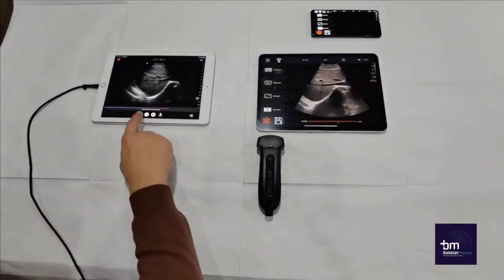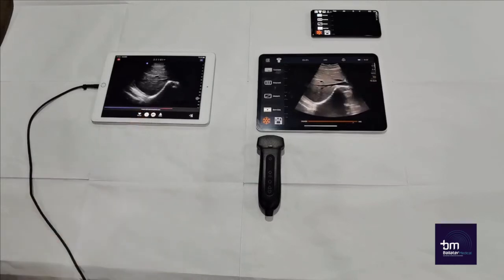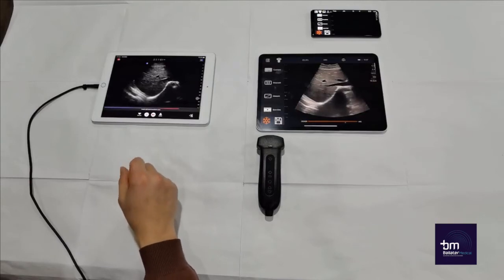As you can see, the Butterfly IQ is already producing a message stating that the probe will reach its heat limit soon. The probe has only been in use for around 50 minutes. Therefore, the continual use time for the Butterfly IQ is around 50 minutes.